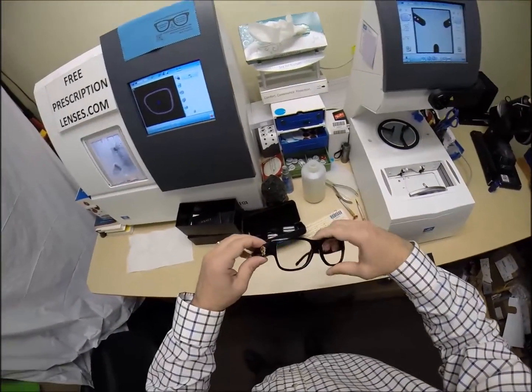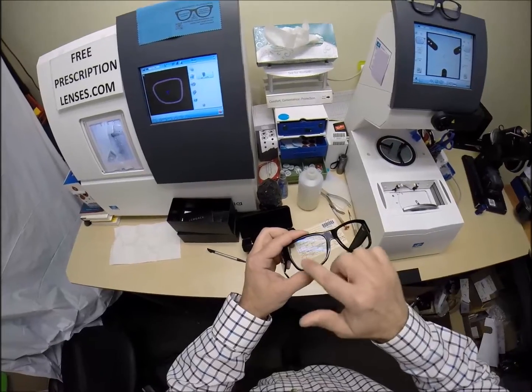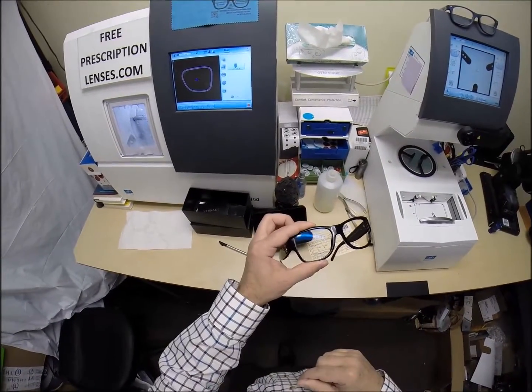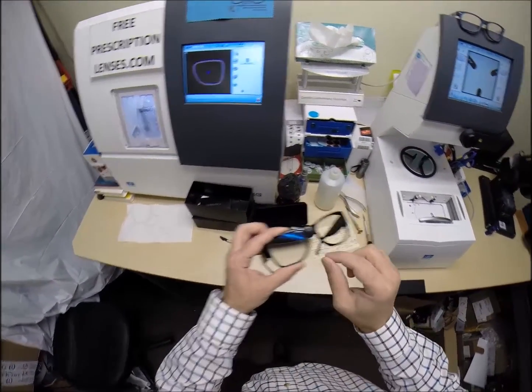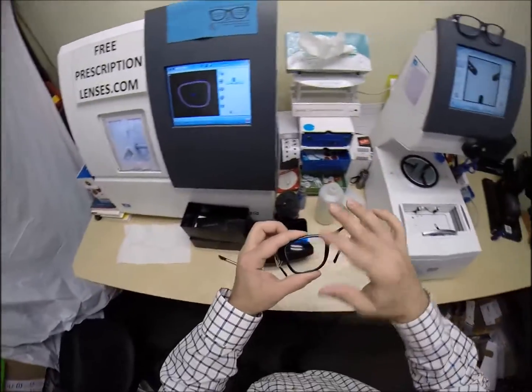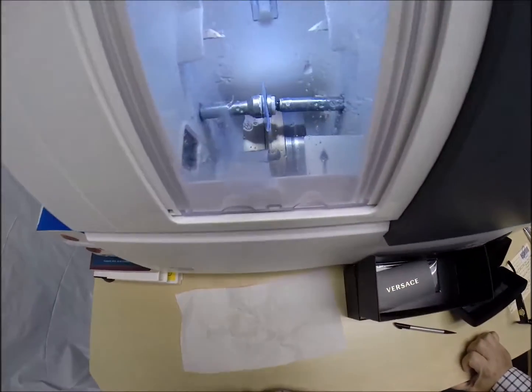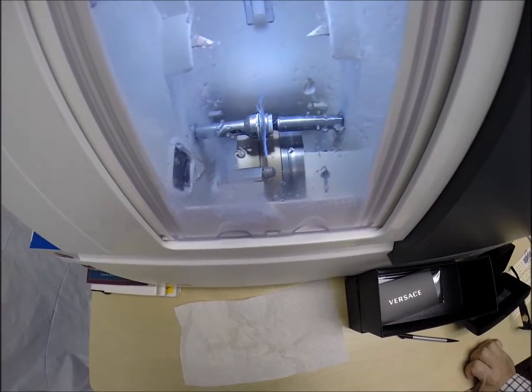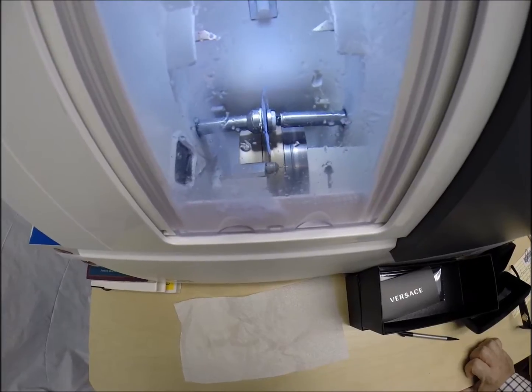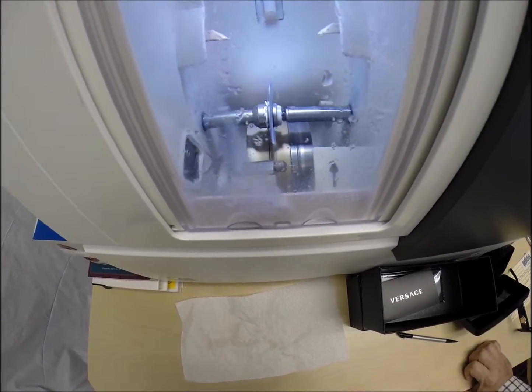Now, having said that, you've got the newest top-of-the-line Crizal Sapphire. That is the premium coating, and now it does have a little bit of a coating on there to help that block that I just took off stick to the lens while it is cutting. This is going to clean up almost clear. Now, Crizal Sapphire is so new, there's only a few machines that can actually apply it. Well, let me take that back. There's only a few labs that have the equipment that can apply it.